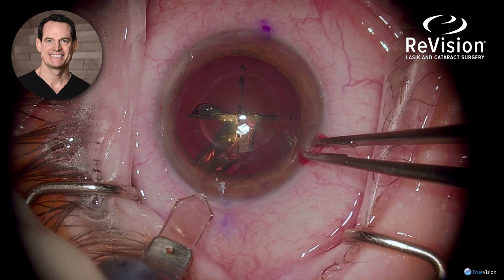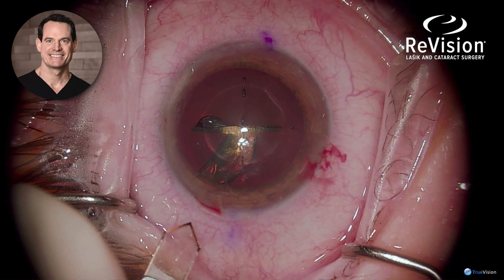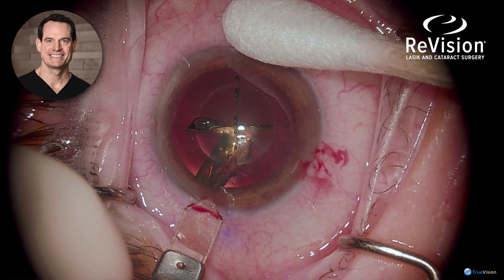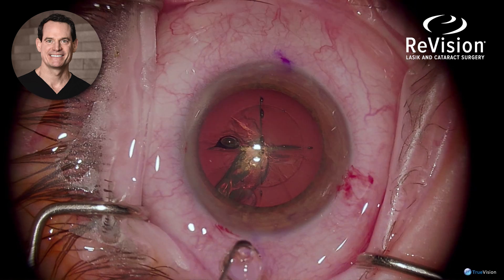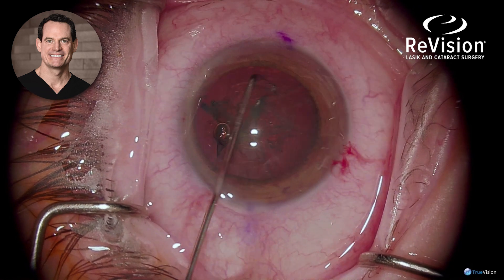Two paracentesis incisions were made, followed by the main keratome incision, which I prefer to make with a score to help the wound seal. Entering slowly allows the diamond knife to create the correct architecture, resulting in a nicely sealing wound, followed by hydrodissection of the lens — ensuring mobility of the lens, which is freely mobile.